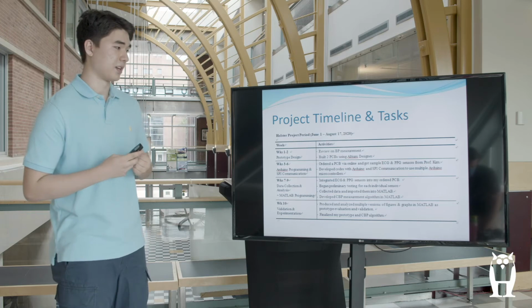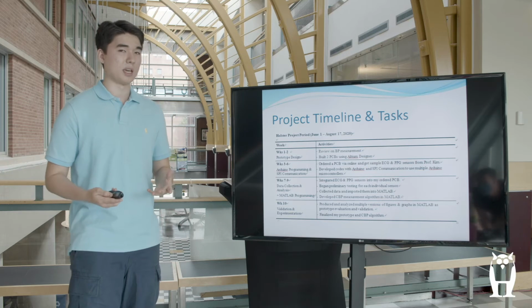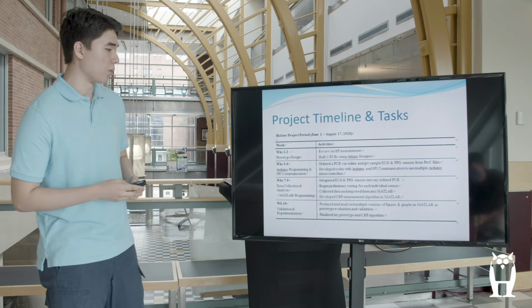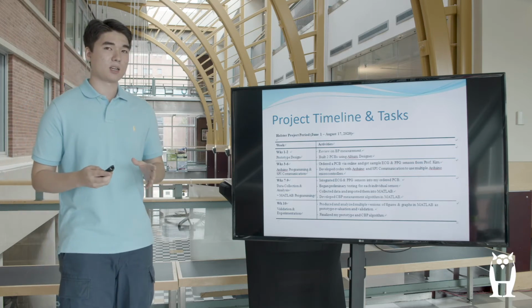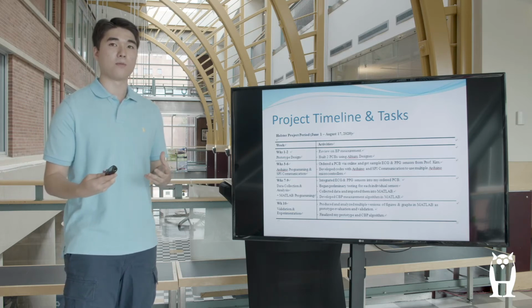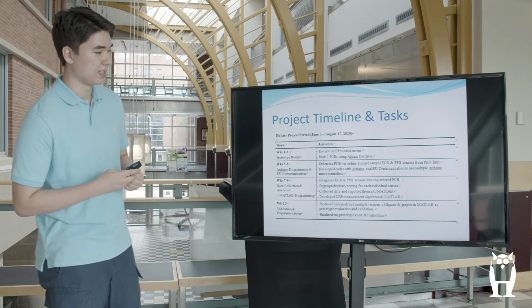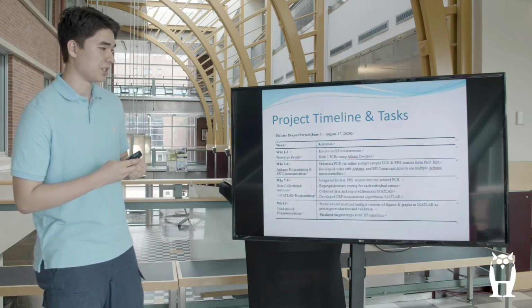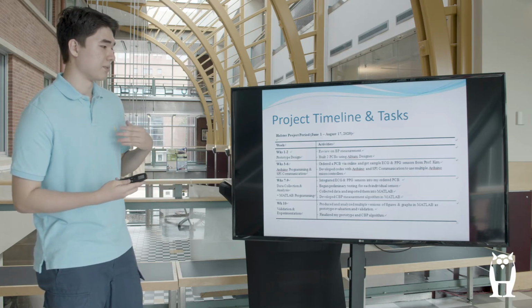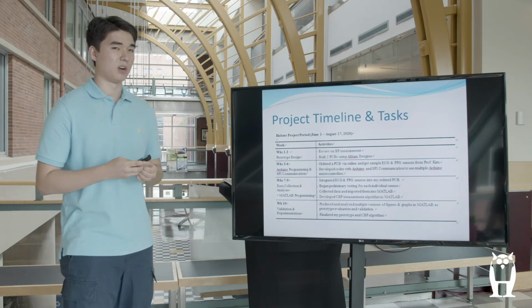from my mentor, Professor Kim, as well as developing code with Arduino and learning more about SPI communication and how that will factor into my final project. Weeks 7 through 9 primarily focused on data collection, me going through trial and error, enhancing my algorithm for detecting continuous blood pressure. And then week 10, validation and experimentation: produce and analyze multiple versions of figures and graphs in Matlab, which is the mathematical program that I used, as well as prototype evaluation and validation, and finalizing my prototype and continuous blood pressure monitoring algorithm.